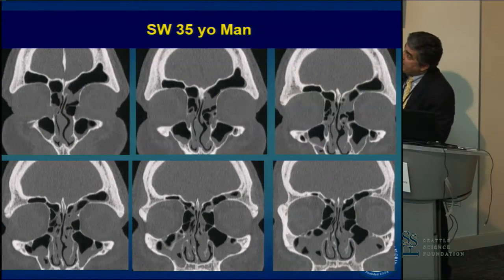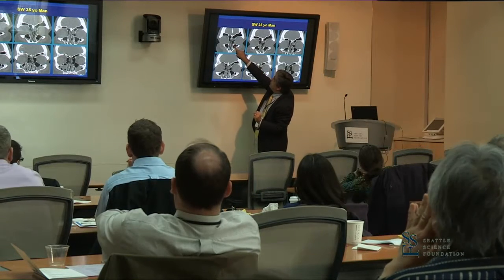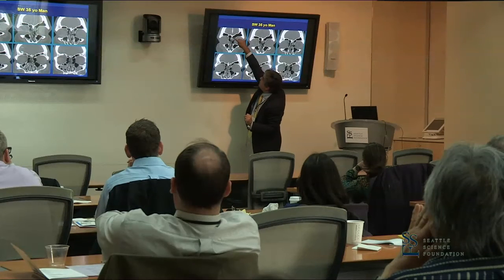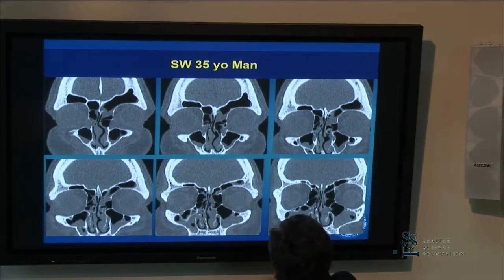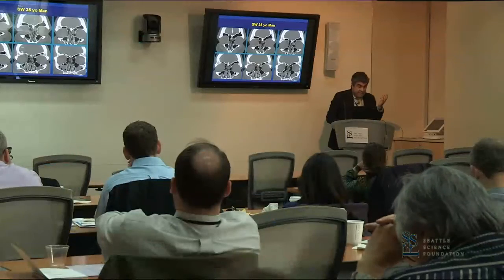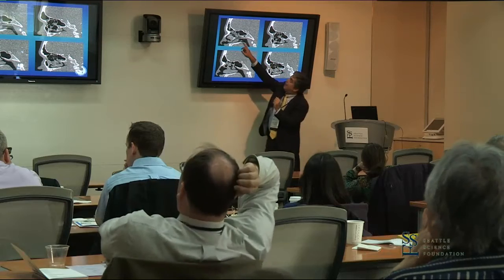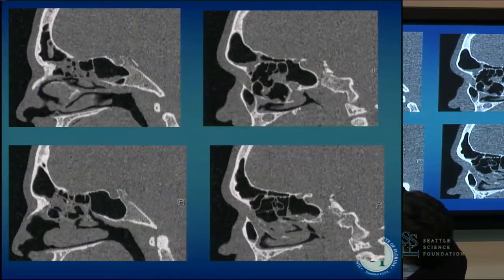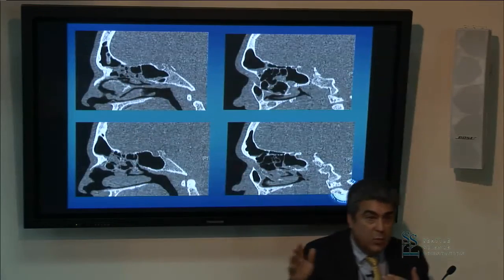The teaching points here: this is the middle turbinate coming over to the lateral nasal wall next to the lacrimal. There are ethmoid cells here, but the frontal recess is going to drain down above and behind what might be an ethmoid bulla. There is not even a clearly identifiable uncinate process to me. This is at the midline — you can see how far back the skull base goes, how wide this area is, and how it can all get opened — but leaving disease here, it will reaccumulate.